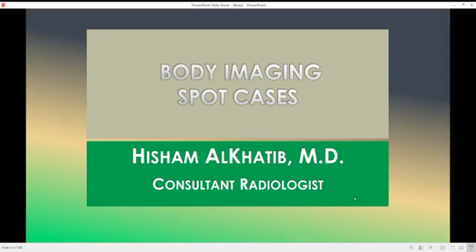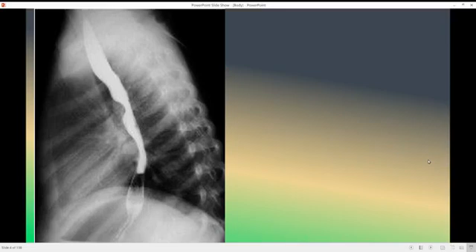This is the second spot cases webinar about the body imaging spot cases. I have 50 cases in this webinar, hoping you like it. We start with the first case.